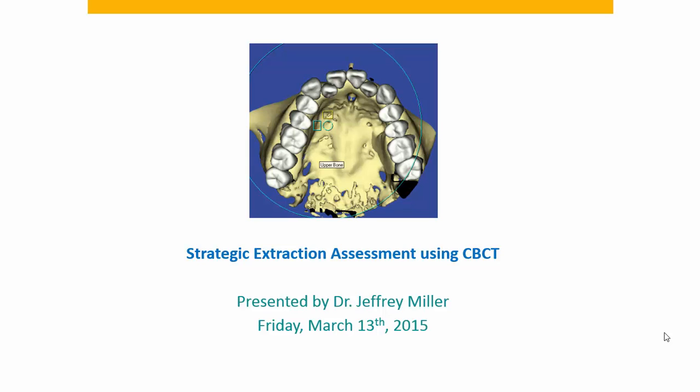Hello, my topic today is strategic extraction assessment using cone beam CT.